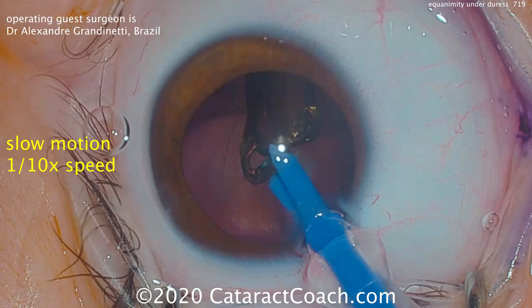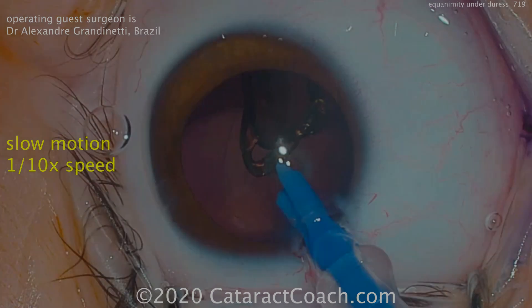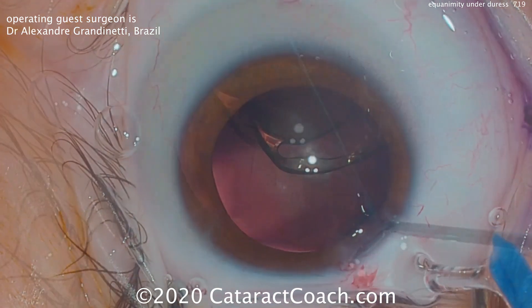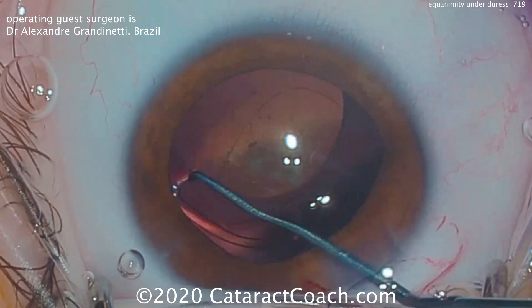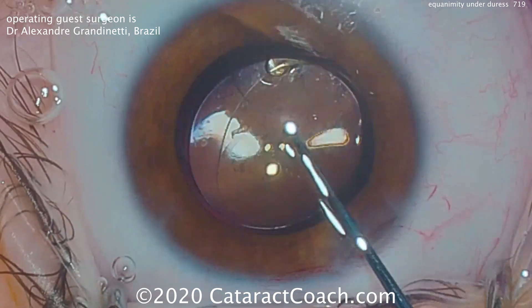This is the time for equanimity under duress. This saying by Osler, reinvigorated by LaSalle LaFalle, a famous American surgeon, means that when things go south, when there's a problem, when there's duress, you have to stay calm and collected. Do what's best for the patient — that's the equanimity.